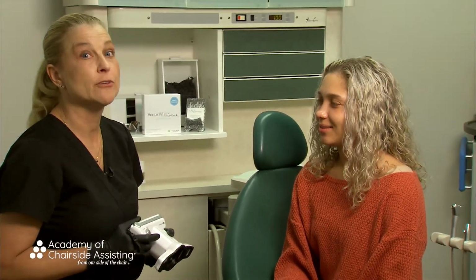So today what I want to do is take a full face of Haley. I'm going to take a smile shot. I'm going to insert some retractors and get a shade tab, because again, I want to know exactly where we're starting, because I know we're going to get a great result because we've already done this with her before, but with this new formula, I really want to document it. So the first thing that I want to do is capture those images that we talked about. I'm going to get a full face, a smile, a retracted view, and a shade tab. And again, remembering where Haley is starting today. Once she starts that whitening process, we can't get it back.